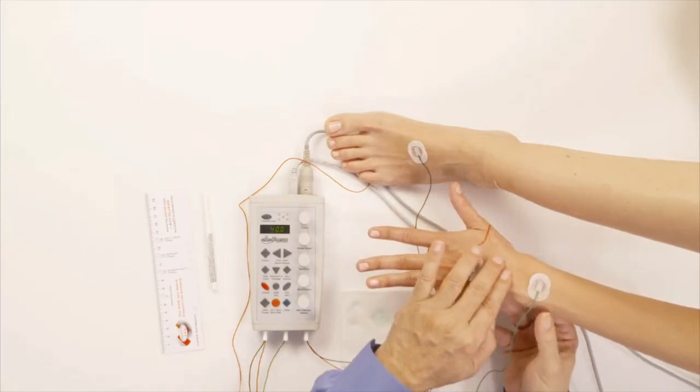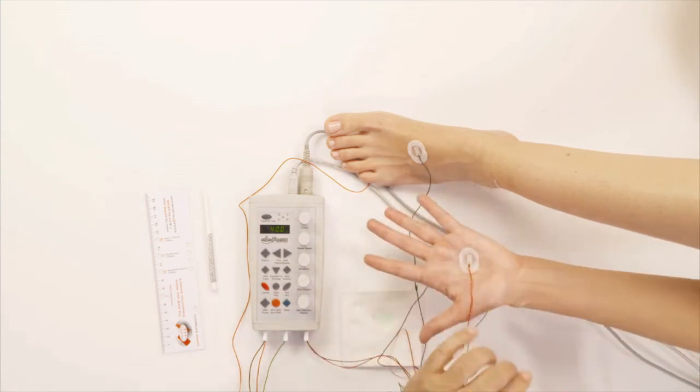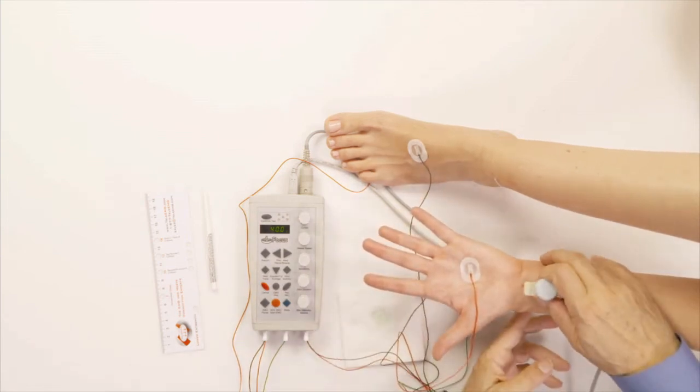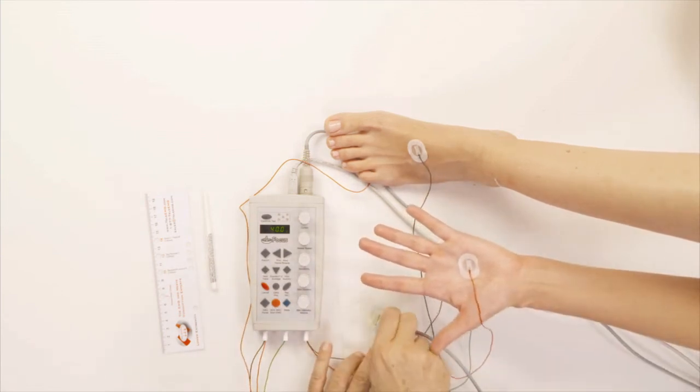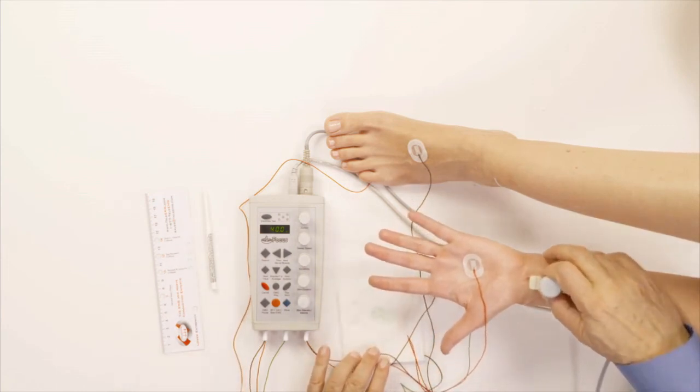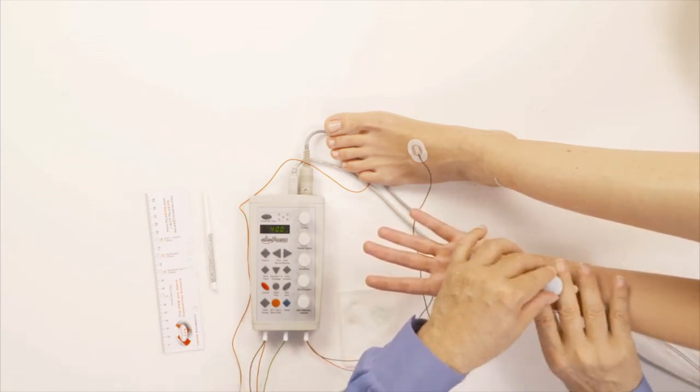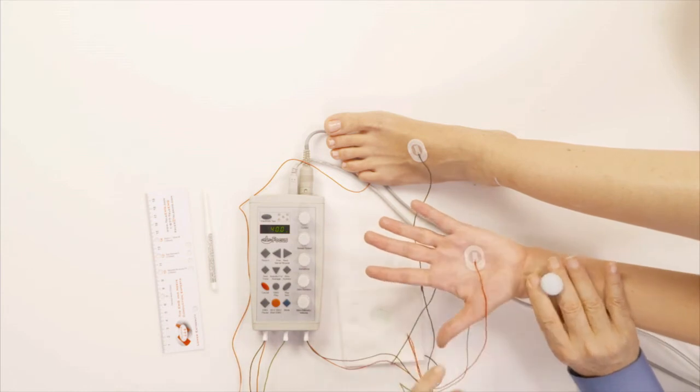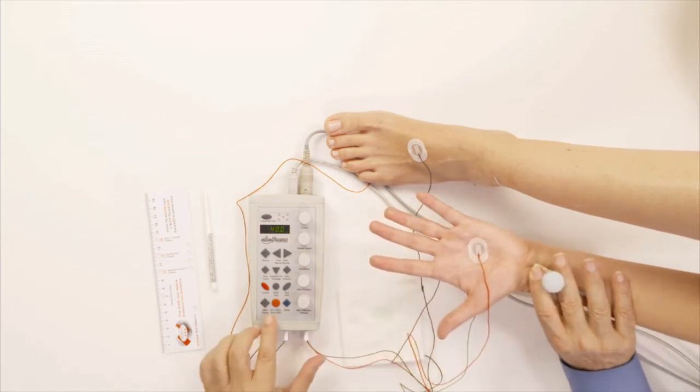So basically, I'm going to put this like so right there, like I stimulate usually for the median nerve, make sure I have enough cream, like I'm stimulating for the median nerve. And I give her just one shock.